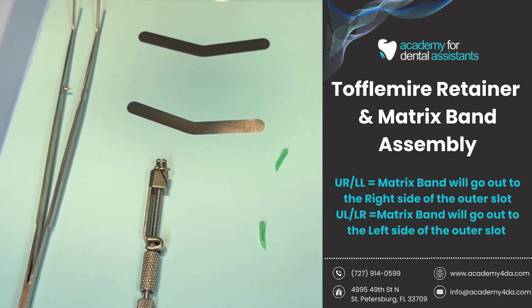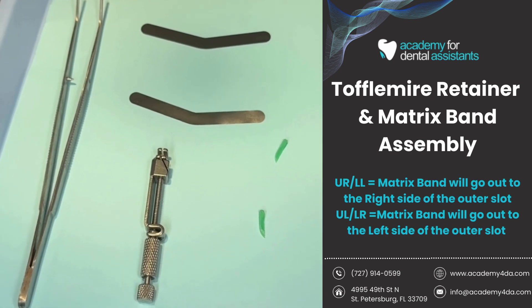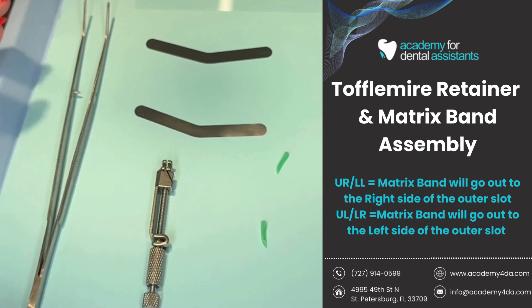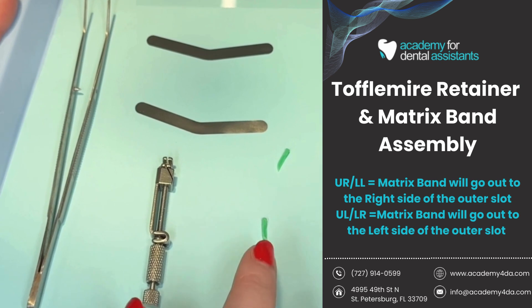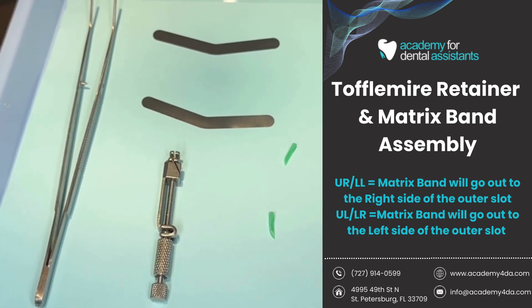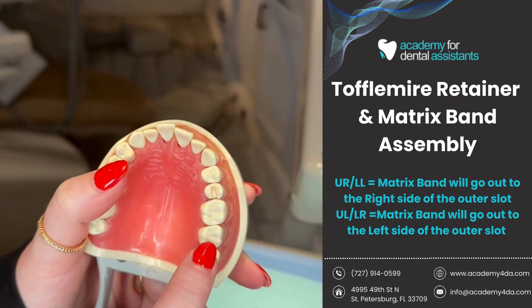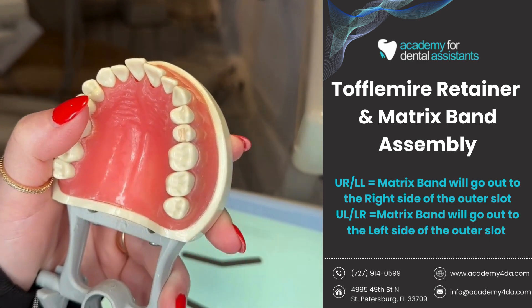Hi students. Today in this video I'm going to be explaining a little bit about matrix bands. A matrix band or some form of matrices system is going to be used to replace the missing wall of a tooth. For posterior teeth, we use a Toffelmyer retainer and a matrix band along with a wood wedge, whereas with an anterior tooth, if we were replacing the missing wall for a procedure or filling, we would use a thin clear strip called a mylar strip. In this example, I'm going to be pretending that we're doing a filling on the DO of tooth number 13.